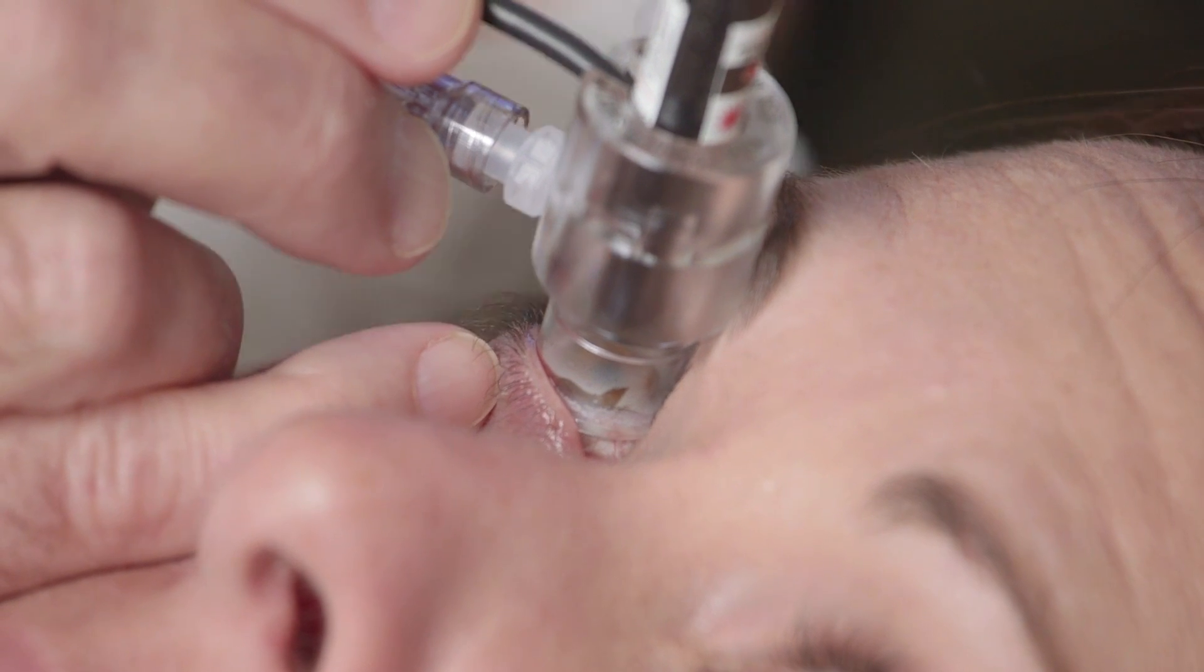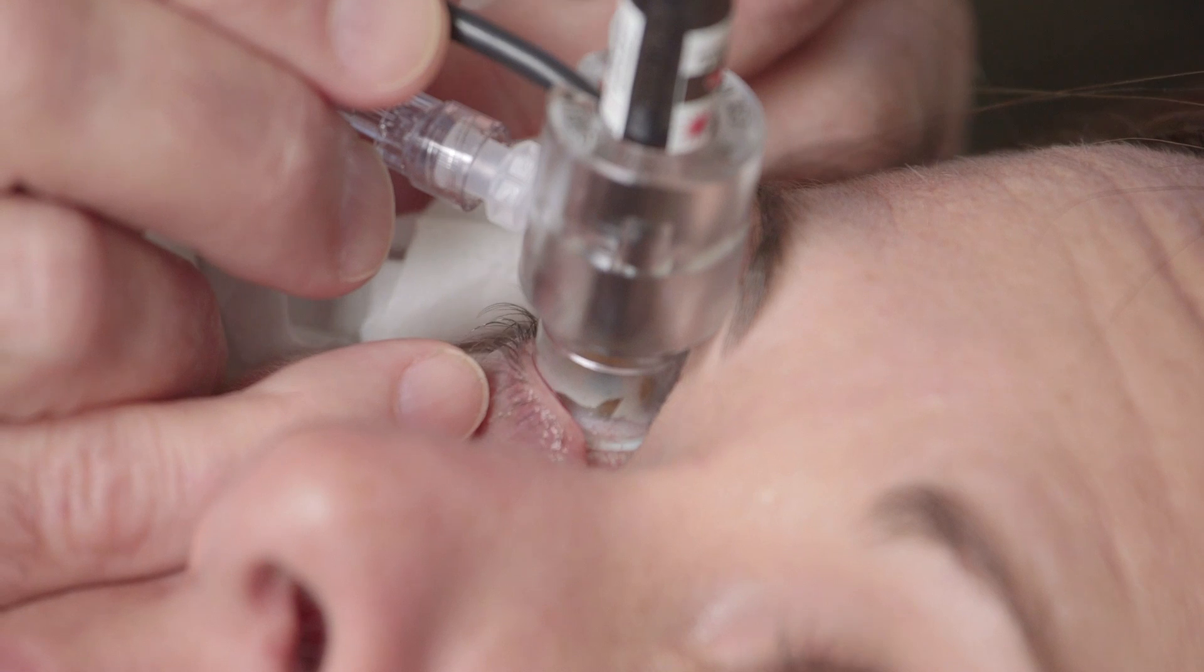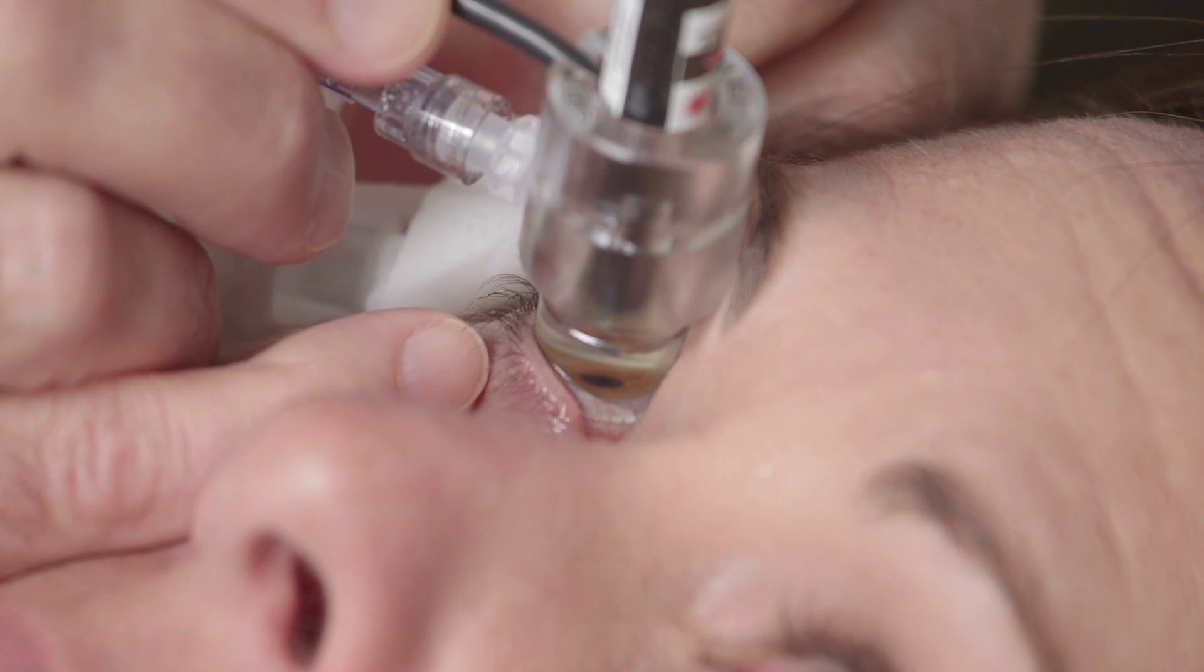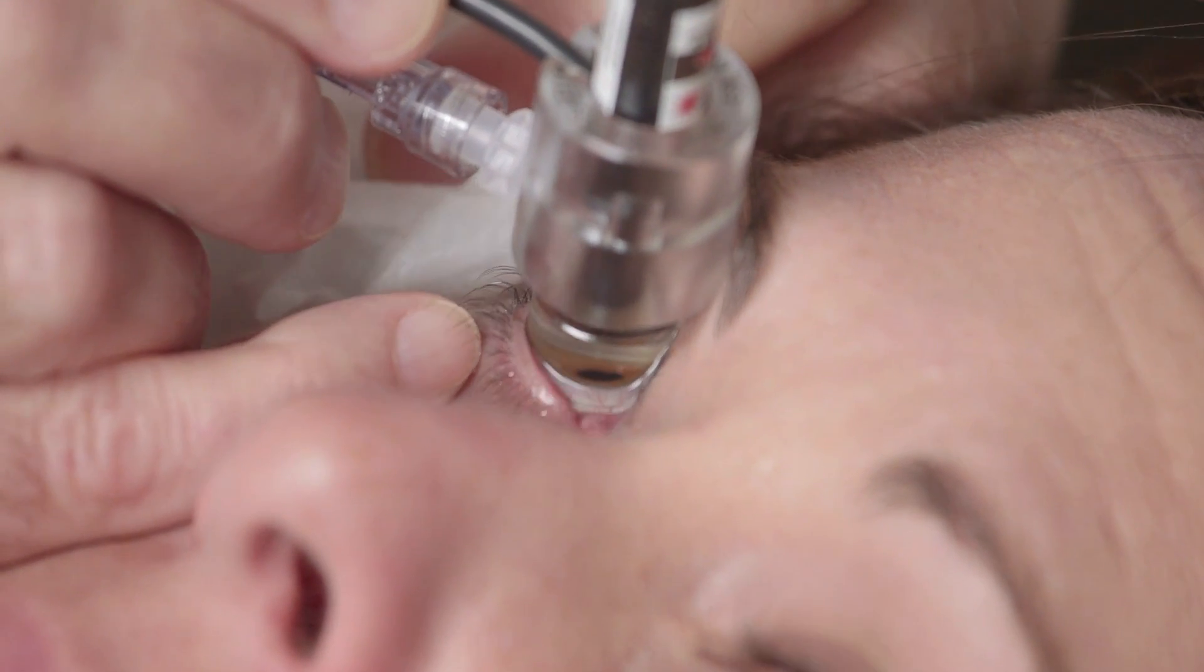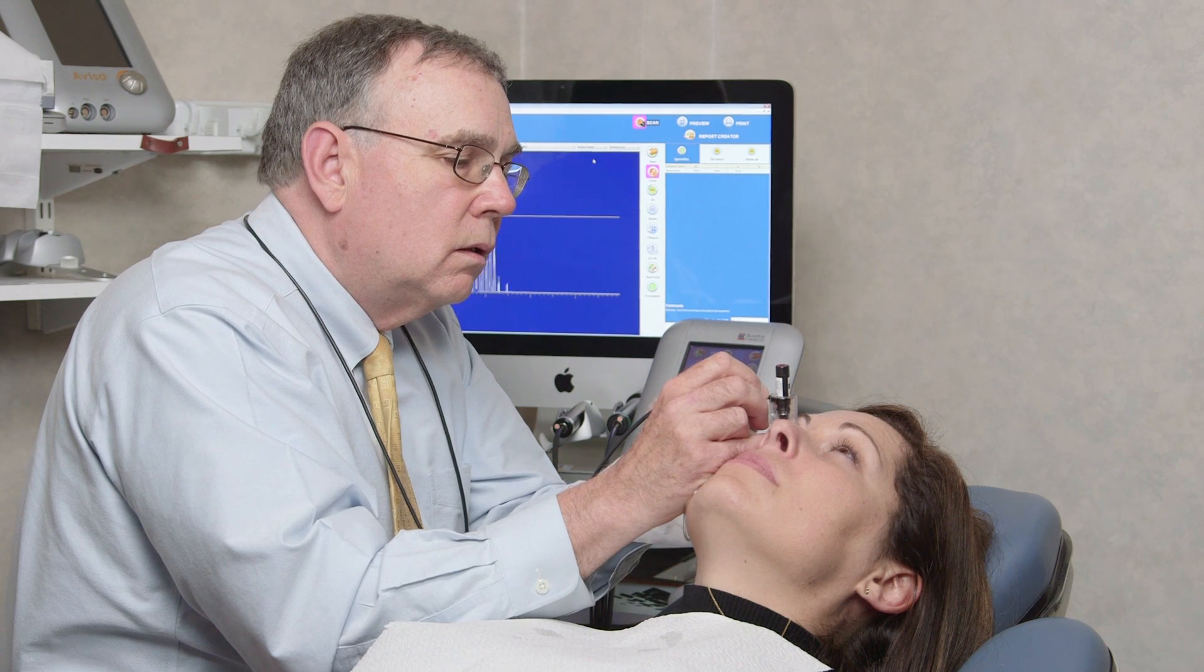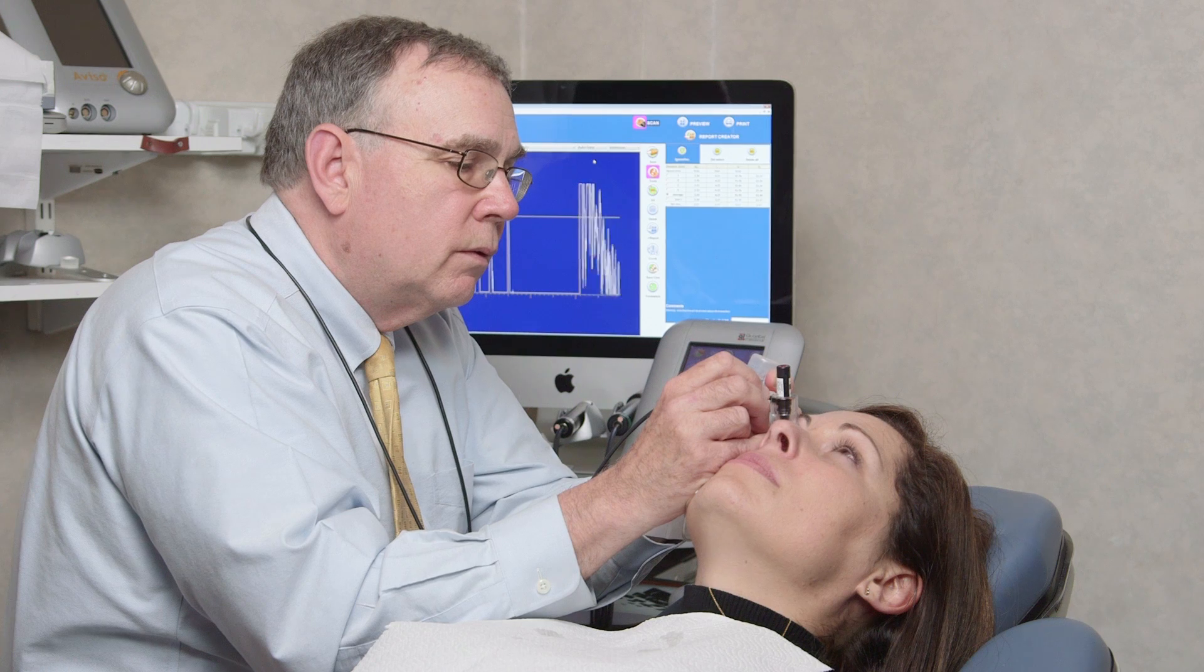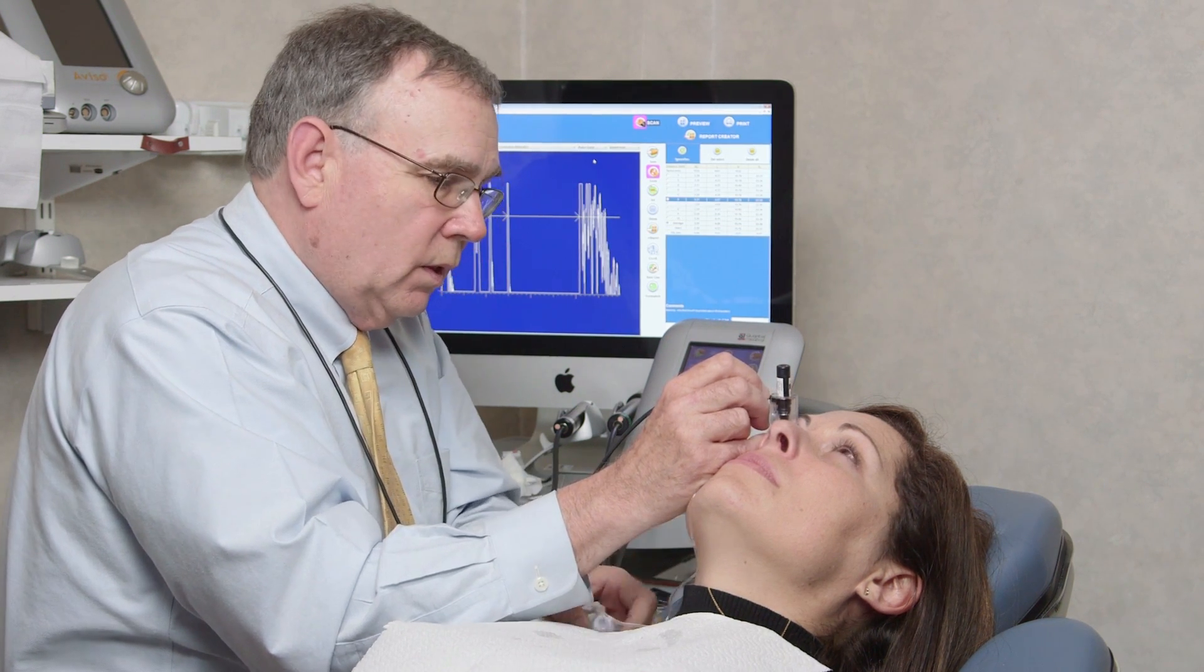The immersion technique is generally considered more accurate for axial length measurement since the cornea is not compressed. A small shell is placed beneath the lids and filled with coupling medium such as methylcellulose, and the probe is immersed in the liquid close to but not touching the cornea. This technique involves a slight learning curve.